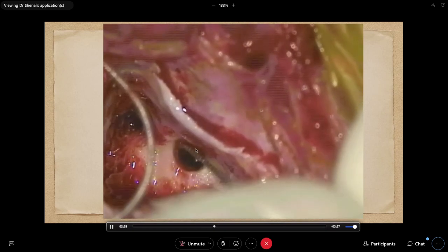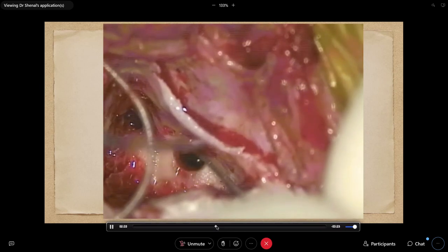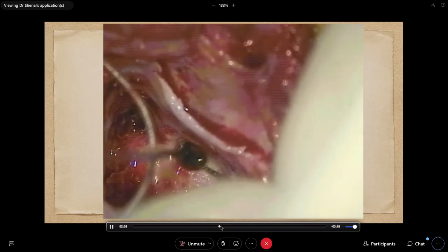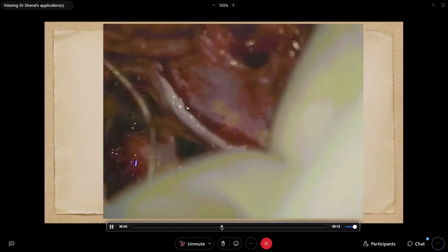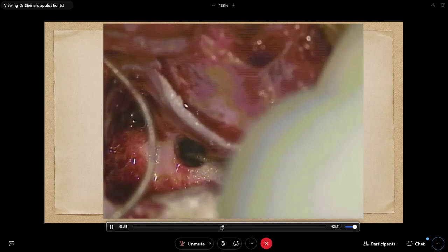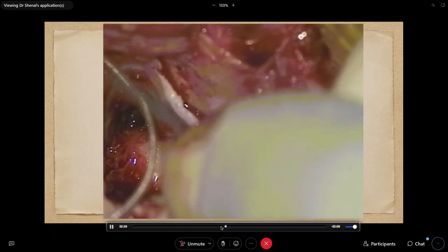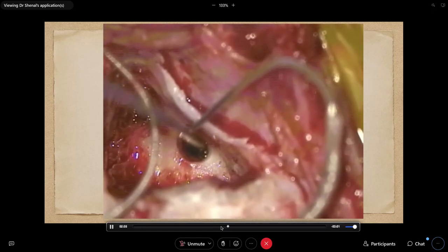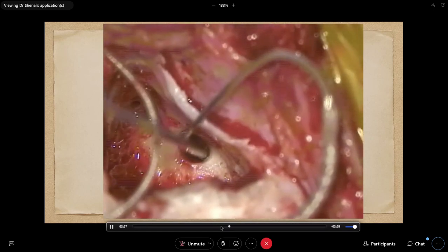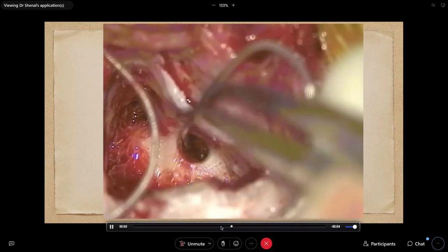So there it goes. Once the electrode is in place, we'll take the soft tissue. This soft tissue we have already taken when we were giving the incision. From there, we take some fat or connective tissue so that we can achieve an adequate seal. So all around the electrode, you should have enough space. Your opening should be wide enough to allow you to seal it with the soft tissue.